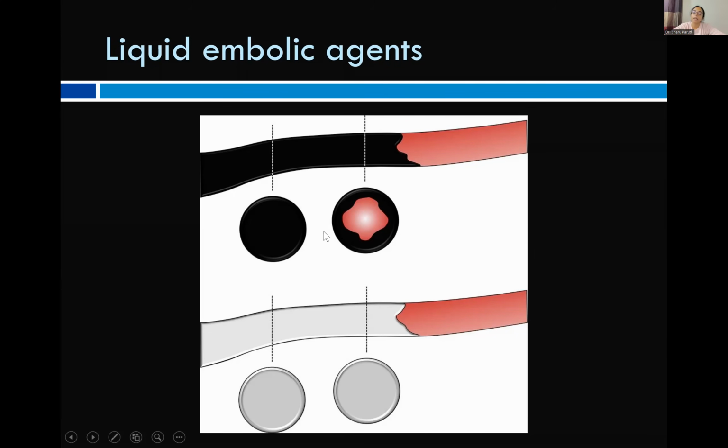So we maintain a small forward pressure all the time so that it can be injected over prolonged periods of time, from minutes to even 1 to 2 hours. If we don't stop, the central portion is not going to solidify. So we can stop for say 2 minutes, then inject some, then stop. The periphery solidifies first, in a rubbery fashion.